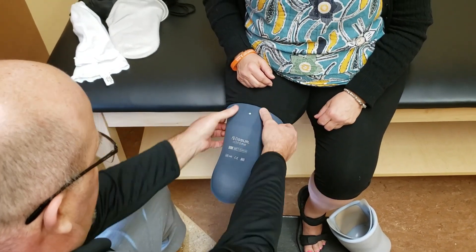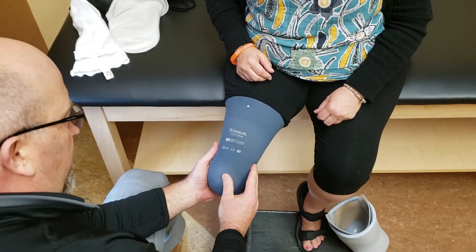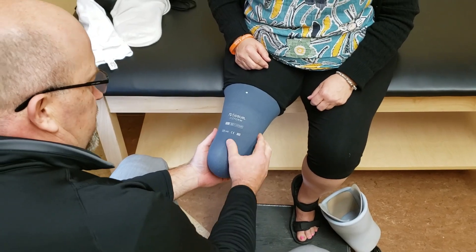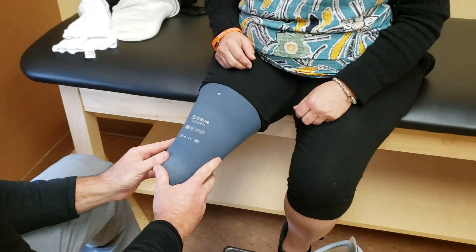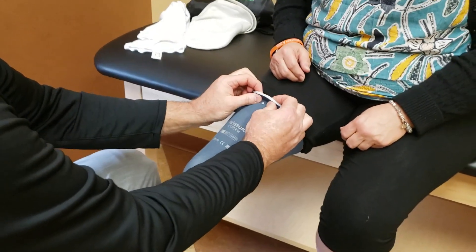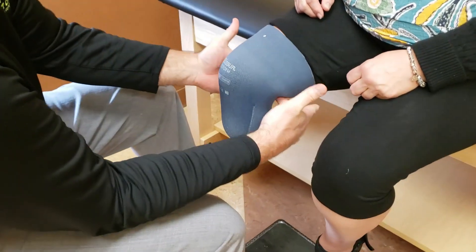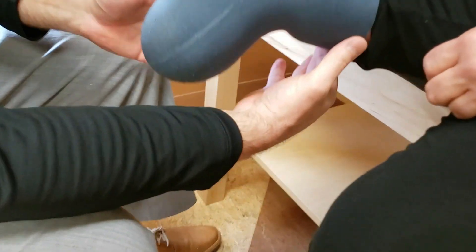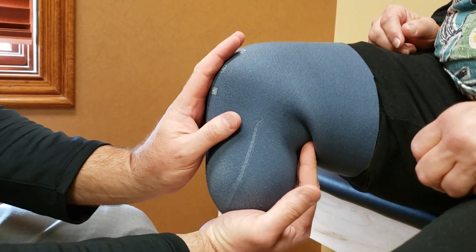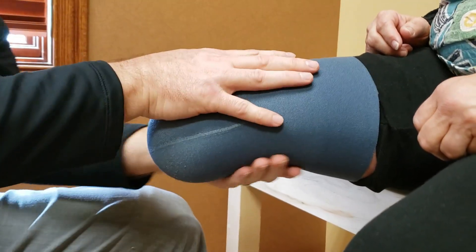The thickness of this liner offers a lot of protection down where there are bony prominent features — the end of the bone from the amputation, the beveling of the bone, the bone on the side. These areas needing extra protection is the main reason it's thicker. Secondarily, when you bend your knee this material has to pleat up, so they thin the back section down to make it more friendly when you flex your knee — thickness is generally not your friend when trying to flex that knee.